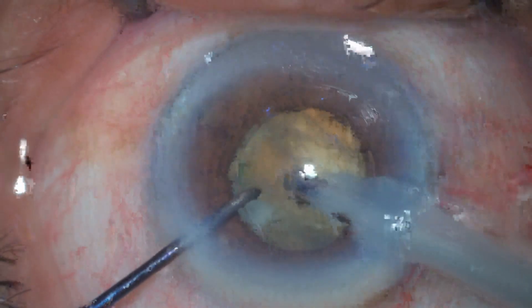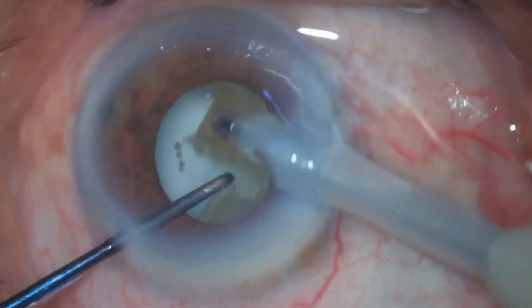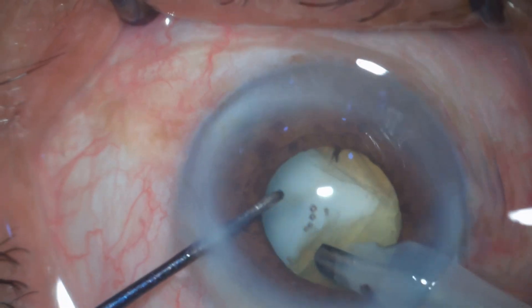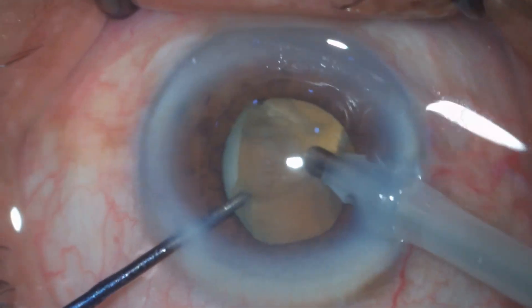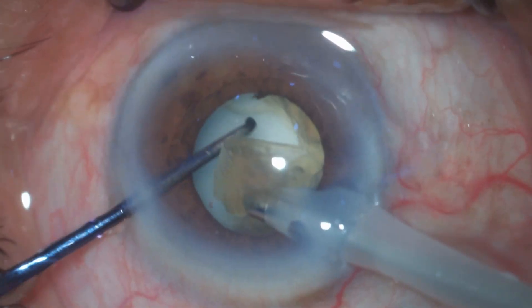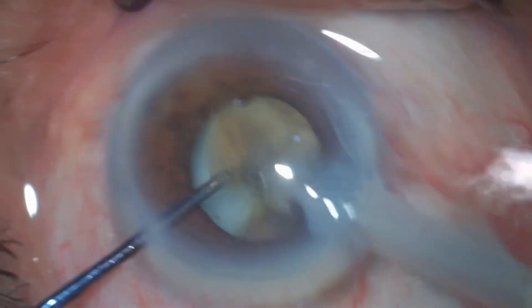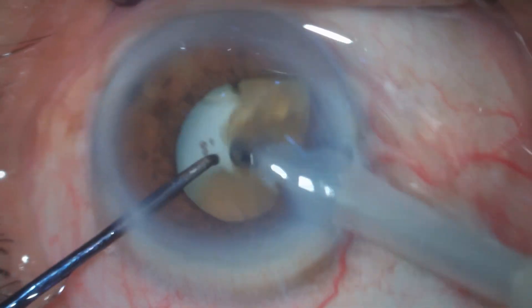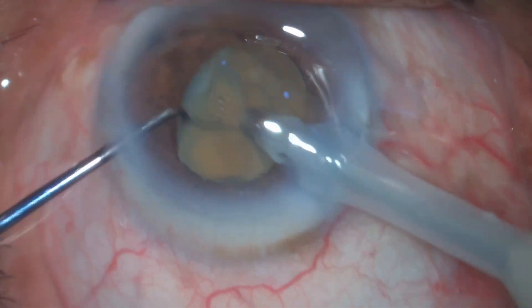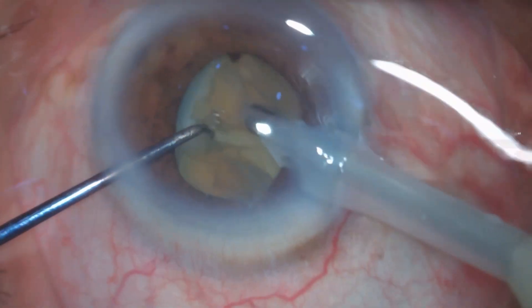I'm emulsifying them one by one. To my surprise, this patient is having a lot of milky fluid in the vitreous, and I'm a little puzzled about what to do with this leaky milky fluid. One option is maybe after putting in the IOL I can later do a YAG capsulotomy, or I can refer this patient to my vitreoretinal colleague for a pars plana vitrectomy.